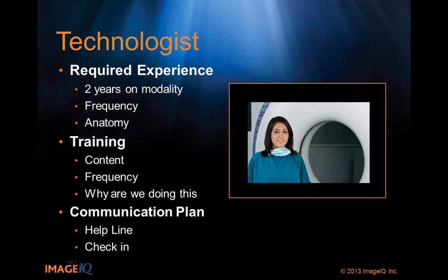If we talk about training, and this really hits training and communication, we want to talk about an engagement plan with your technologist, and that's how I would think about both of these. We want to answer the question of why we're doing this for the patient, and communicate that well to the technologist so we get buy-in and adherence to the protocols and flexibility with the patients, things that we really need to make sure the images we get at each time point are great quality images.